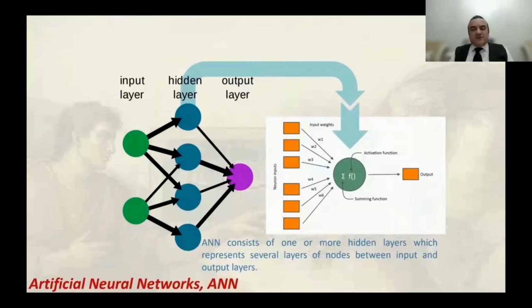If you give me, as a radiologist, a panoramic image or any 2D or 3D image and ask me to extract features, I can classify maximum 10 of them, such as this is radiolucent, this is radiopaque, or if there is a lesion, the lesion is expanded, it is going beyond the cortication, and so on. But I can define maybe a maximum of 10.